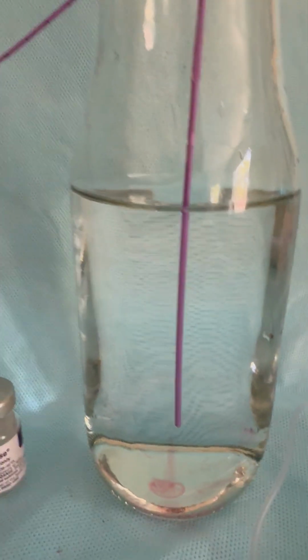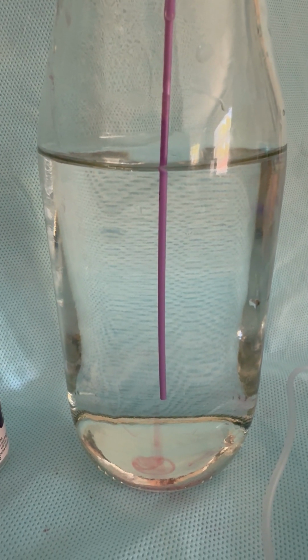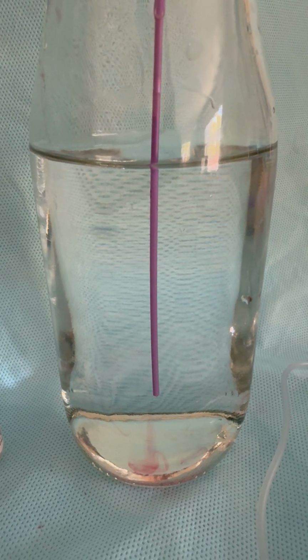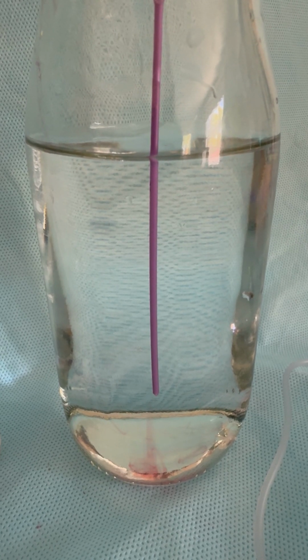So where is that Cathflo going? If our heart beats 80 times per minute, 2 liters goes by in a minute, it's in the vascular system. It's not at the tip of your catheter anymore. So when you go to draw back, you're not getting 2.2 milliliters of Cathflo.